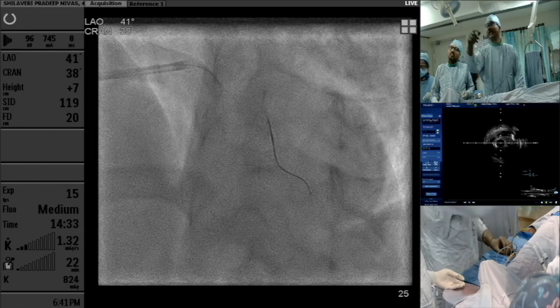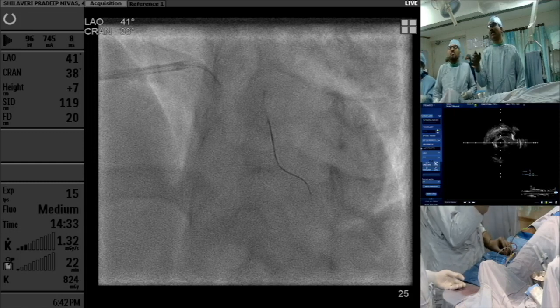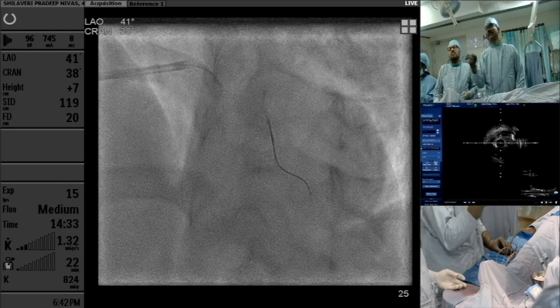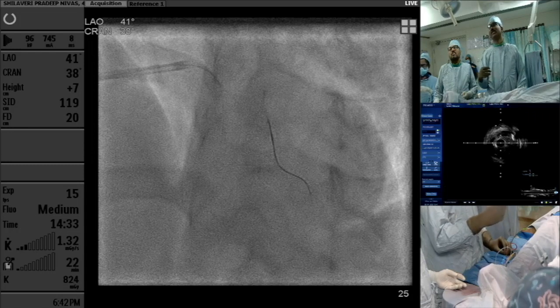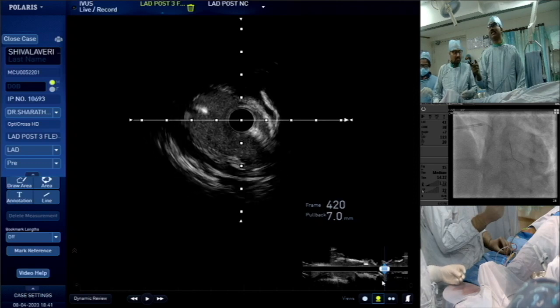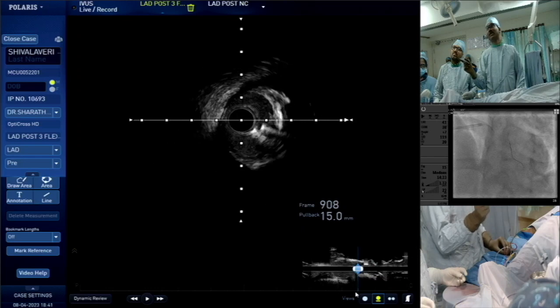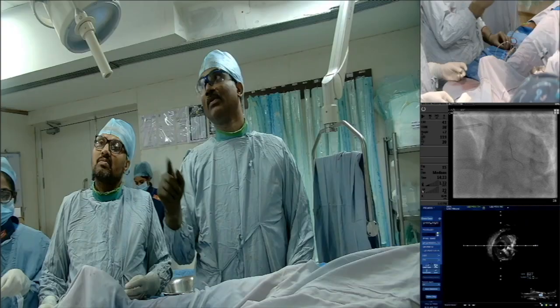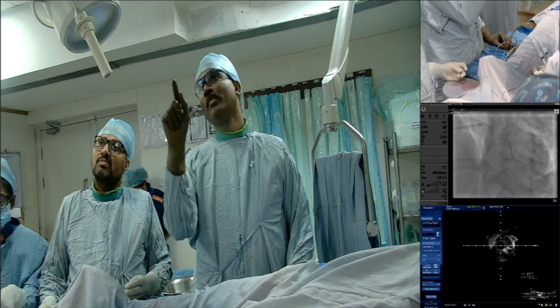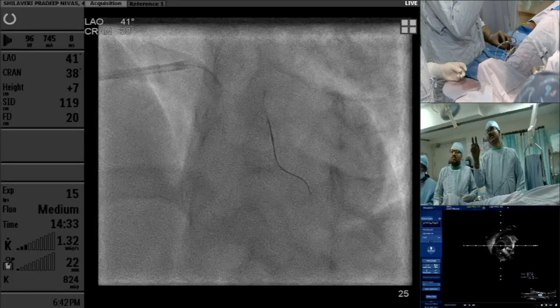There is a big diagonal. If I end up overlapping onto diagonal, let's say my first stent I land below diagonal or above diagonal. Here I have to land above diagonal. And if my second stent goes onto diagonal, then you are overlapping that branch with two stents, which is not good. So you better put a proximal stent first, up to either end before diagonal or end after diagonal, and then take your second stent with overlap in that non-branch zone. You can see the zone before diagonal there are no branches, zone after diagonal no branches.